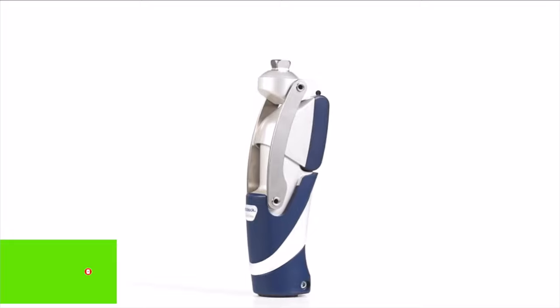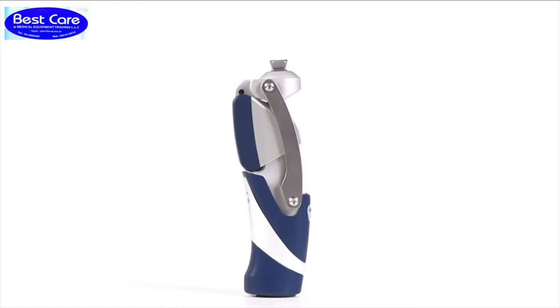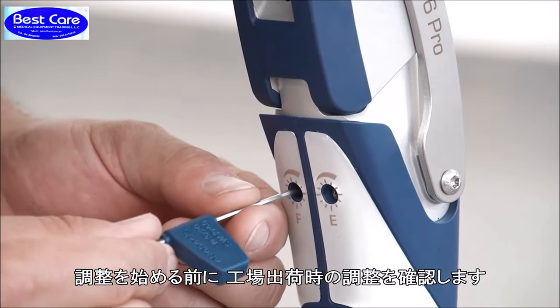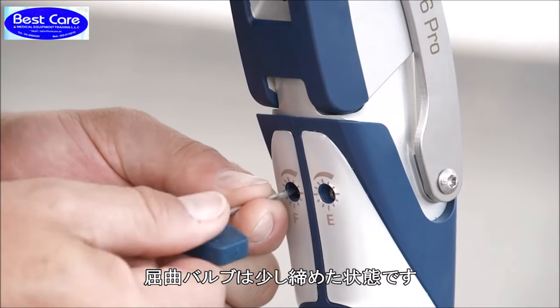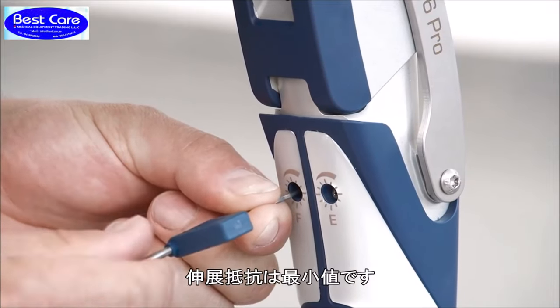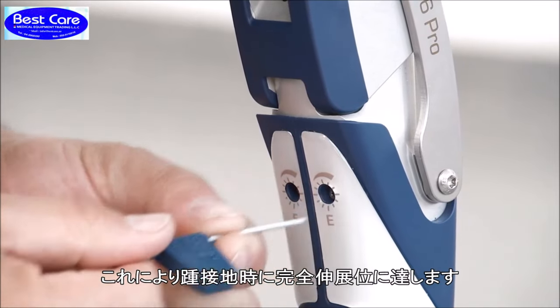The 3R106 Pro is approved for Mobis 2 and 3 users with a maximum body weight of up to 125 kilograms. Before fitting the user, please check the factory settings. The flexion damping is set with the valve slightly closed, meaning that it is turned 2 times to the right from the left-hand stop. The extension damping is set with the valve fully open, so that the prosthesis is always in full extension at heel strike.